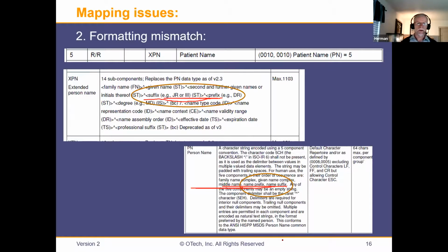So you actually need to have the book in hand. I don't know if you're familiar with it. I have this little DICOM reference guide that I created one time, with all the tables of all the different attributes and all the different value representations. I use it all the time because I have to find out, are there any mismatches in lengths and in definitions? Okay, cool.